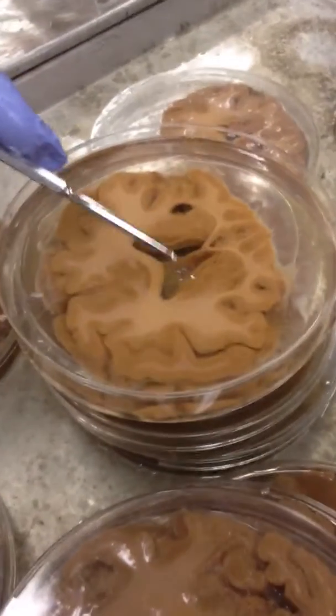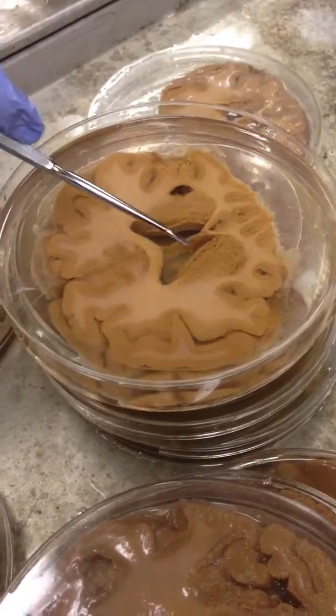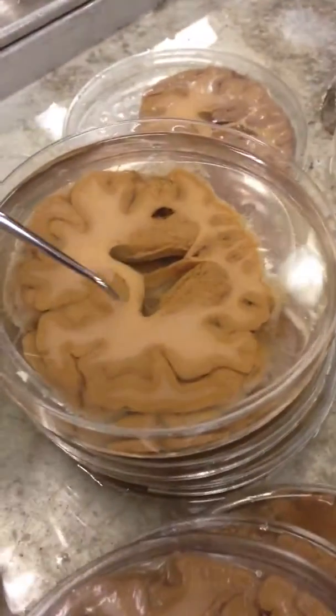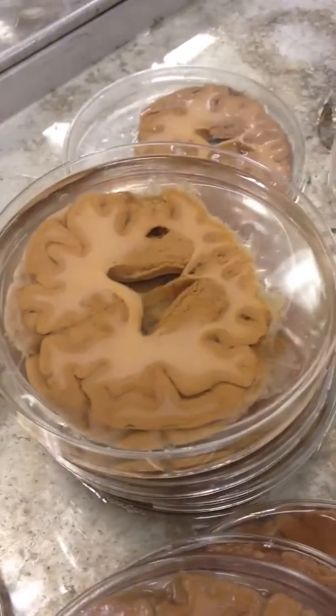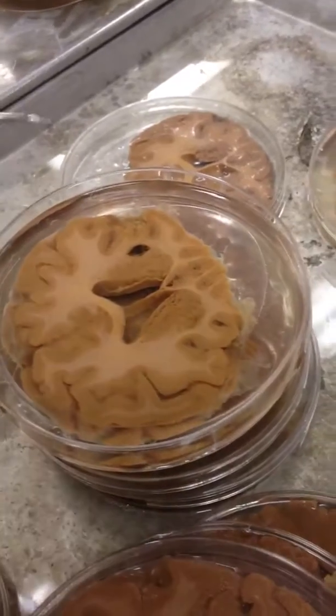Head of the caudate nucleus. Yeah, what's this? That's the beginning of the putamen. That's right. And then you can also see a suggestion of cellular bridges here. Now, what's that? Oh, looks like a vascular accident of some sort. Yeah, that was a CVA. Hemorrhage. Yeah, it's a hematoma or a hemorrhage.